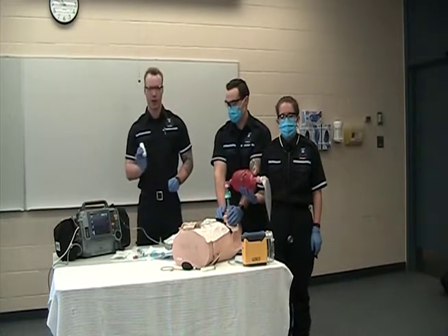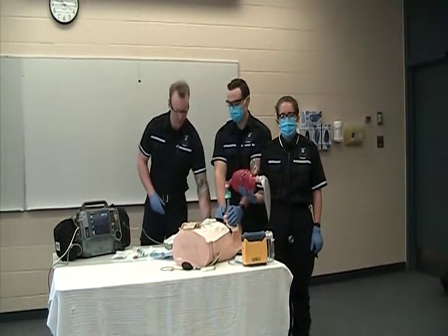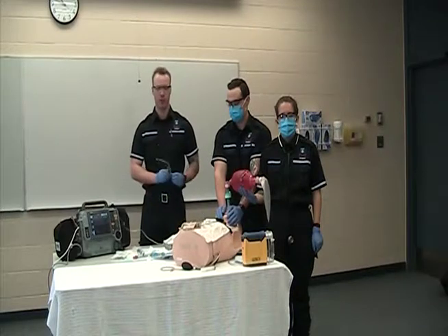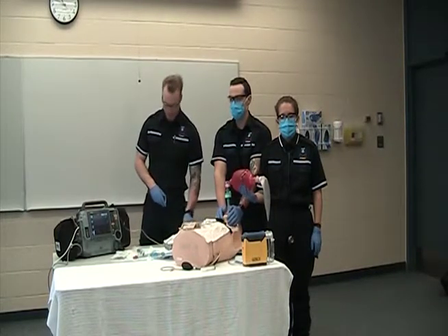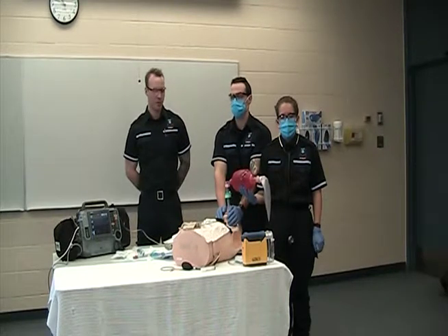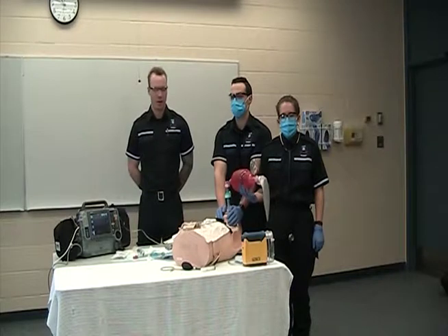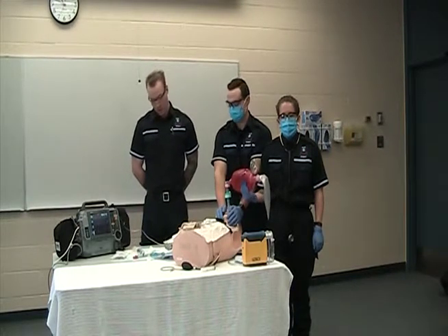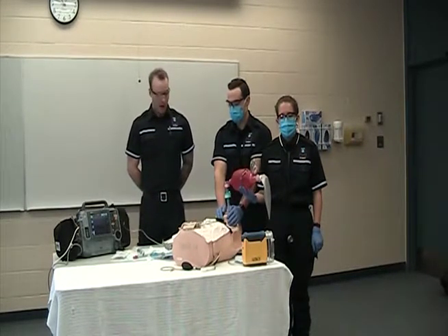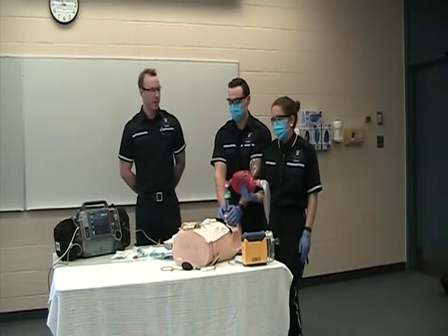We have our lubricating spray, which we can spray on the bottom of our ETT. We have our Magill forceps in case we have a foreign body. And we have our NPAs already in the patient's nose, providing pre-oxygenation. We have our cric kit open and laid out and prepared on the patient's chest. So now we'll go through our checklist and make sure we have everything ready before we intubate.